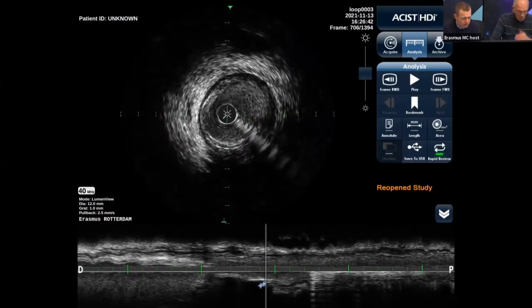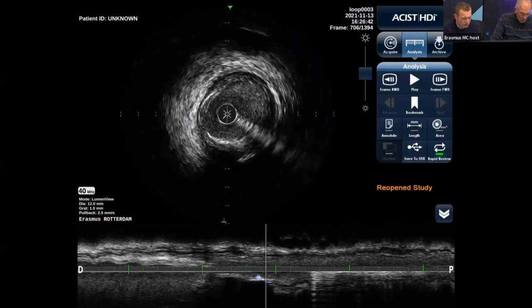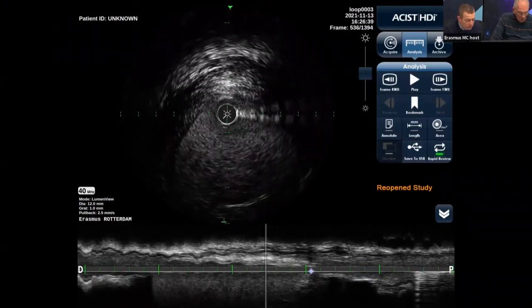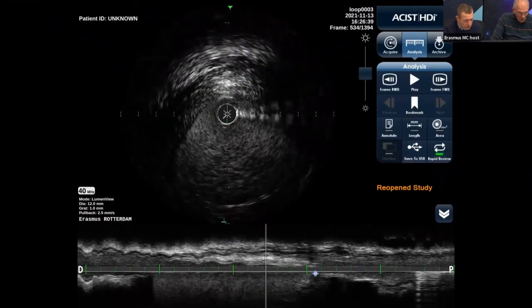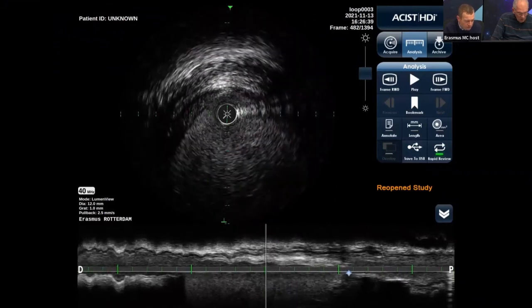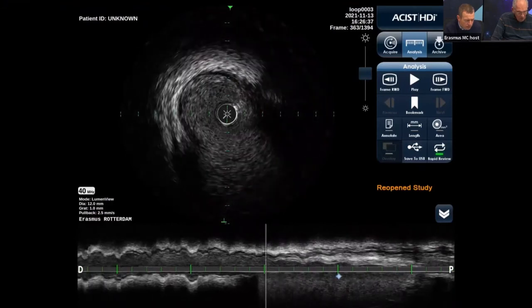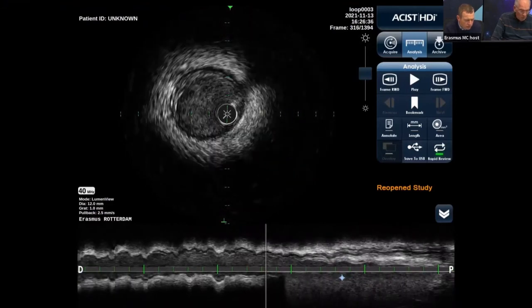What is interesting in this case is that if you go distal in the aneurysm, you see that the vessel is patent. There is not much to do for stents. And distal to the aneurysm, that's also patent, actually very healthy. So also here, there's no need for stenting.